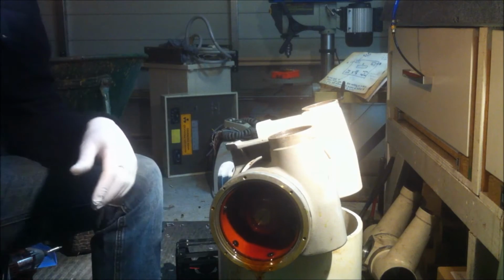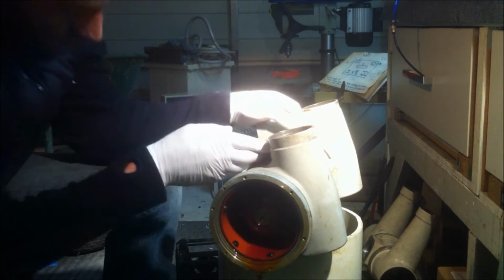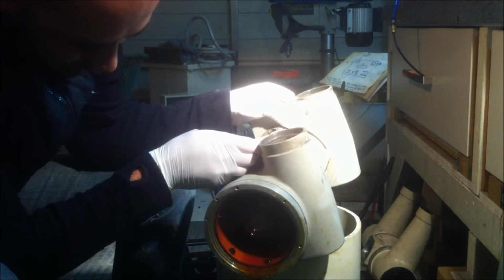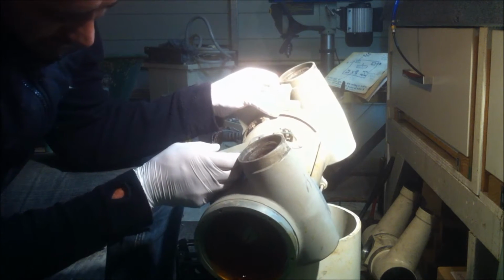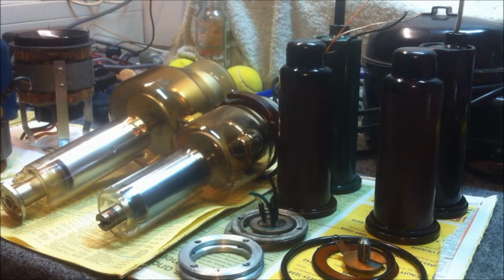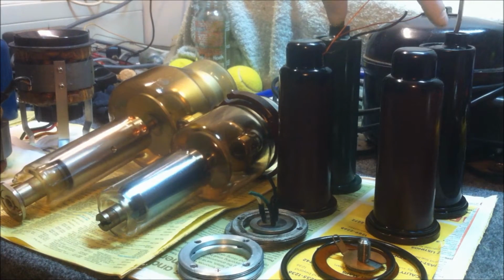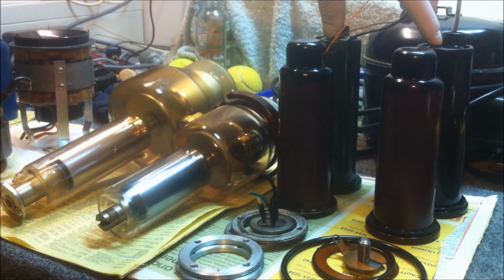Just almost ended in disaster. Bloody oil everywhere. Well, I had to stop the camera and clean up all the oil that I spilt on the floor, so I didn't bother filming the teardown of the second X-ray head because that would just be pretty boring to watch twice. But I've got everything up on the bench now that I want to keep.